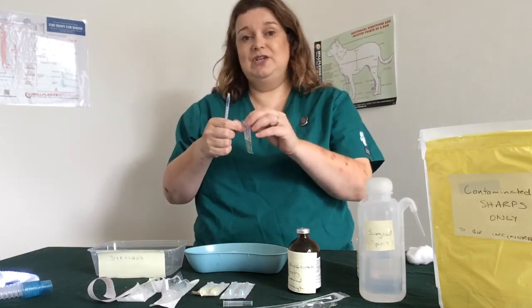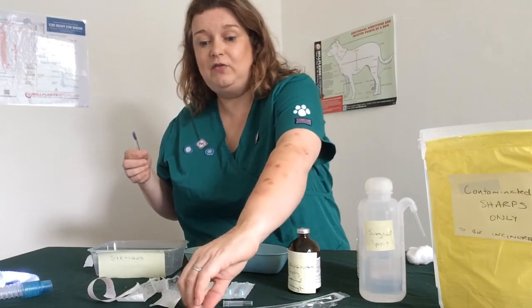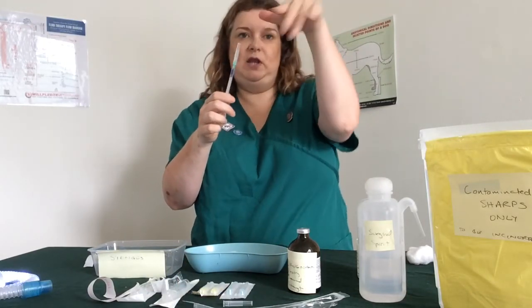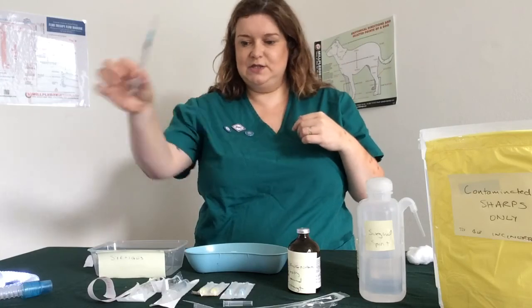Have this here. If you're worried about your hand shaking, open the needle and do exactly the same as you did with the syringe. So open the needle and have it sitting ready to go. Pick up. That is safe handling. So this is not a naked needle. I can do what I like. And I've drawn up 0.1, and I would give that to the examiner.